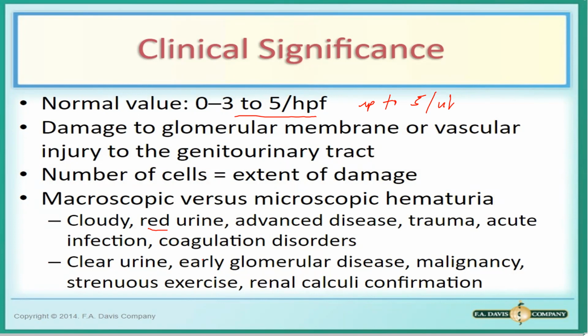Physiologic cause, number one, strenuous exercise. You can see it with hyaline, RBC, cast or granular casts. And then yung contamination is due to menstruation. Okay, so always ask po si female patient if they have menstruation.